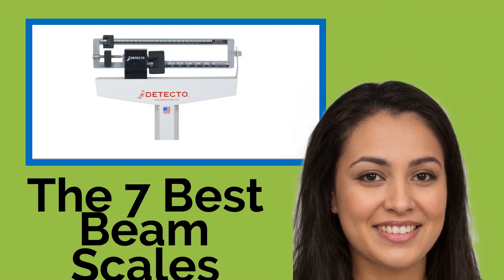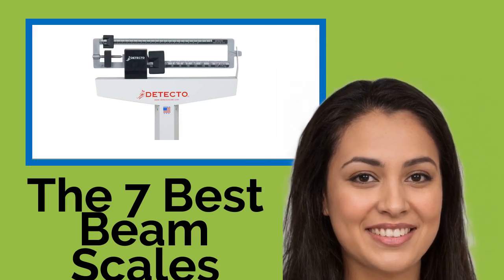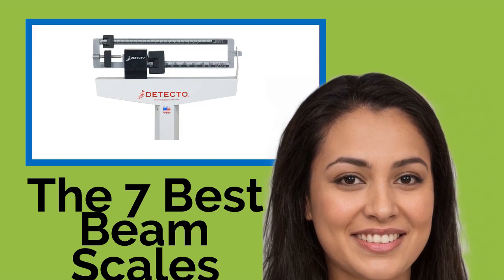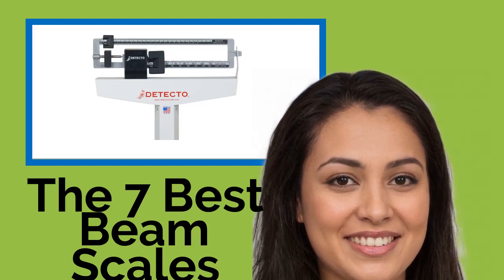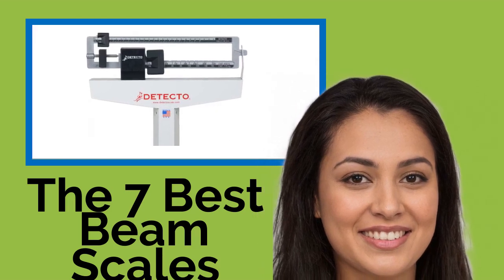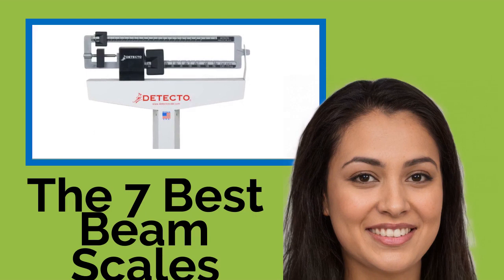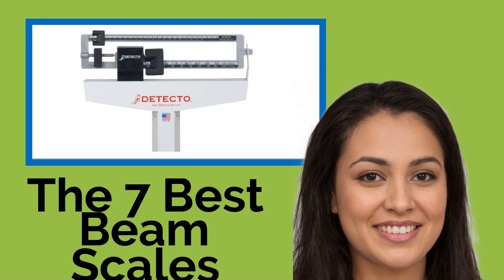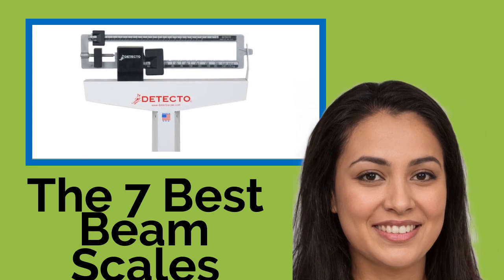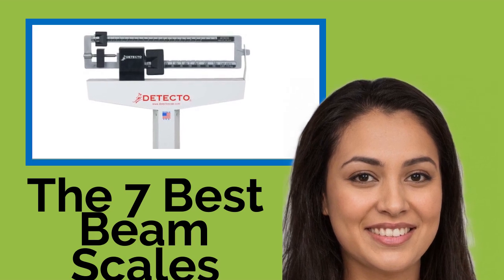The 7 Best Beam Scales. If your clinic, physician's office, or hospital needs to accurately record a patient's mass rather than their weight, like typical bathroom scales, you'll find one of these professional beam scales perfect for your business. We've also included one of their smaller brethren, a triple beam, for scientific and industrial measuring purposes.